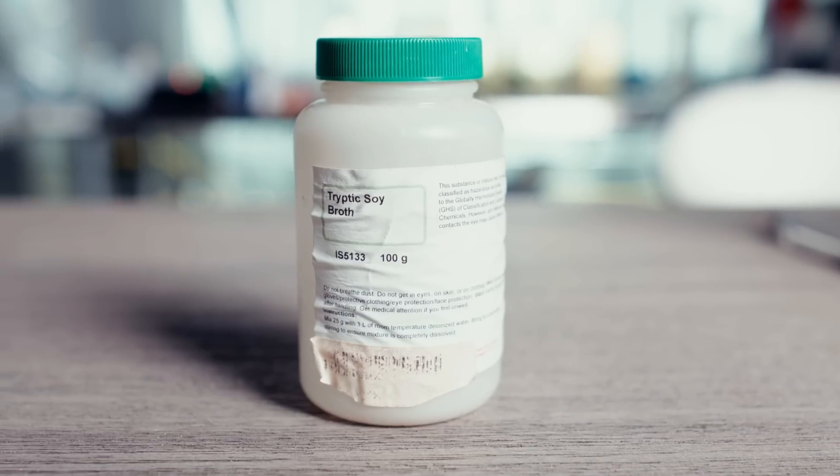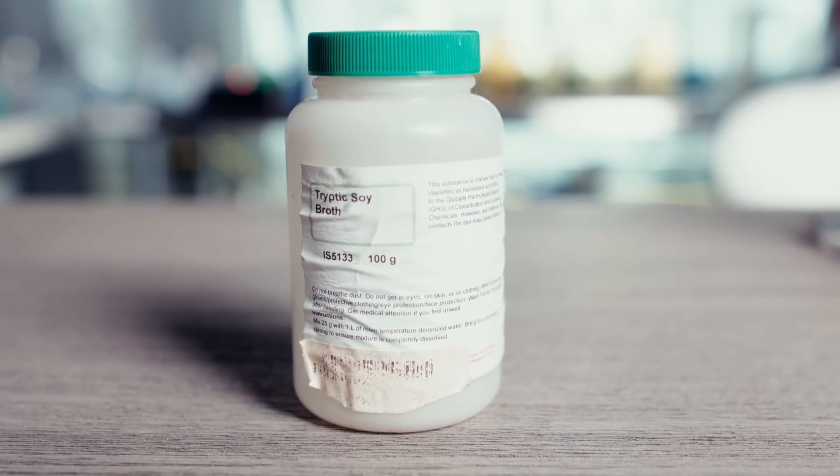The tryptich soy broth has a casein protein and a soy precursor, which is relevant to my farm because in the bulk substrate I use soy hulls. The idea is that this recipe will prepare the mycelium for advanced feeding in the bulk substrate stage. It's more refined than honey — a concentrated tryptich soy powder that is lab grade — so it will have fewer contaminants and be less challenging for the mycelium to grow.